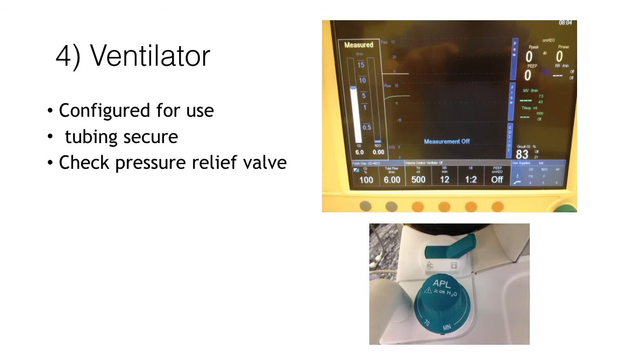Check that it is set to however many centimetres of water you want it to, or set to minimum. And check that the switch indicating if you're using the ventilator or the reservoir bag is correctly set.